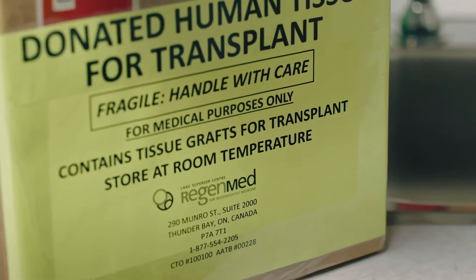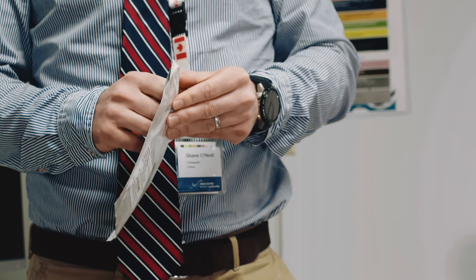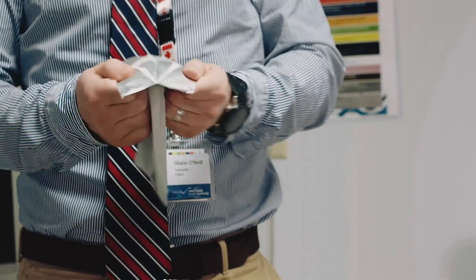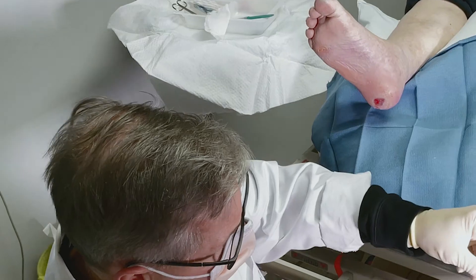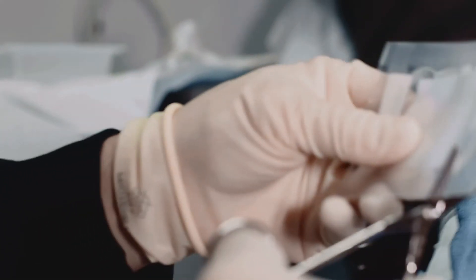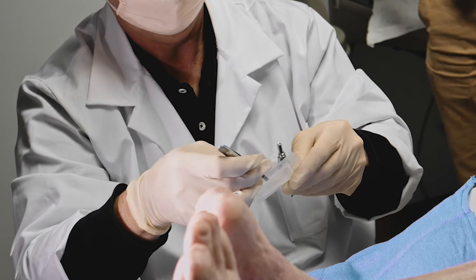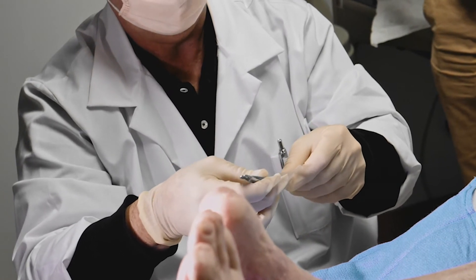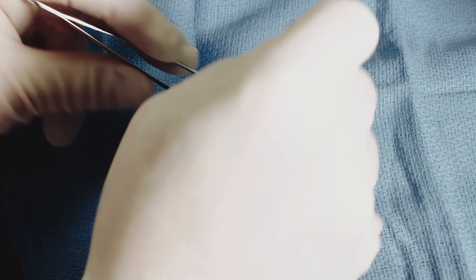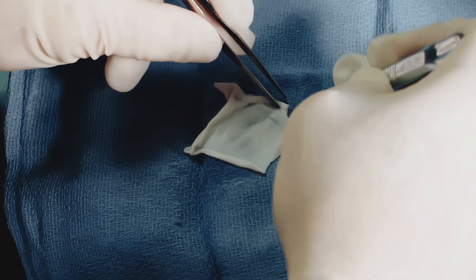Select a Dermagen graft that is the closest match to the size of the wound to be treated, with some overlap. Peel back the non-sterile outer package, remove the inner package using sterile gloves and forceps. Using sterile scissors, cut the inner package and take the Dermagen graft from the pouch using sterile forceps and place it into a sterile dressing tray or onto a sterile mat.